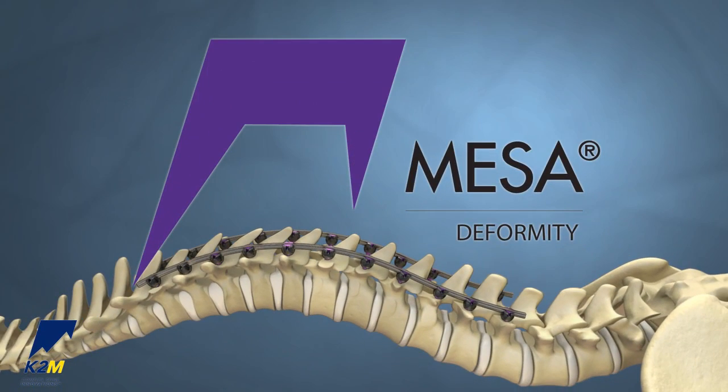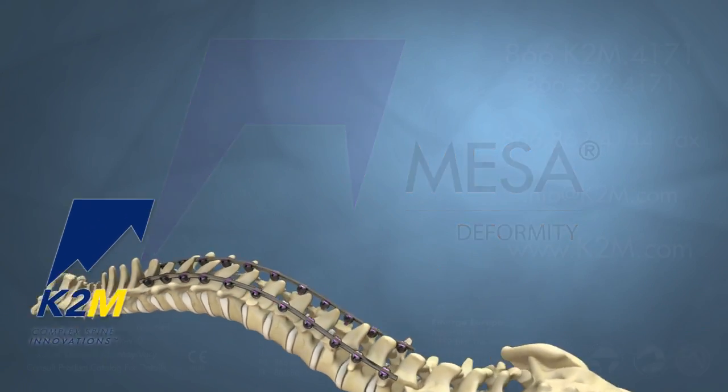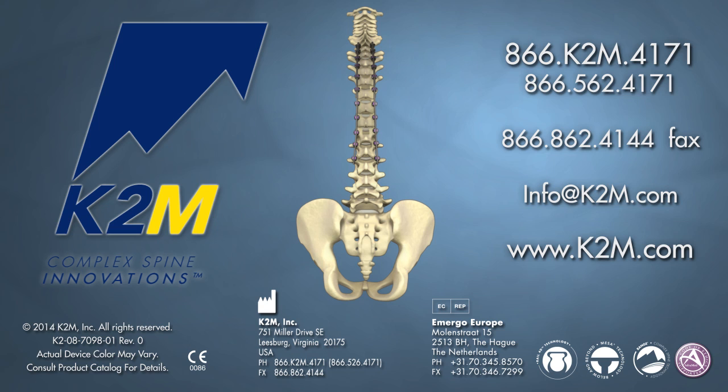The MESA Deformity Spinal System from K2M, Complex Spine Innovations.